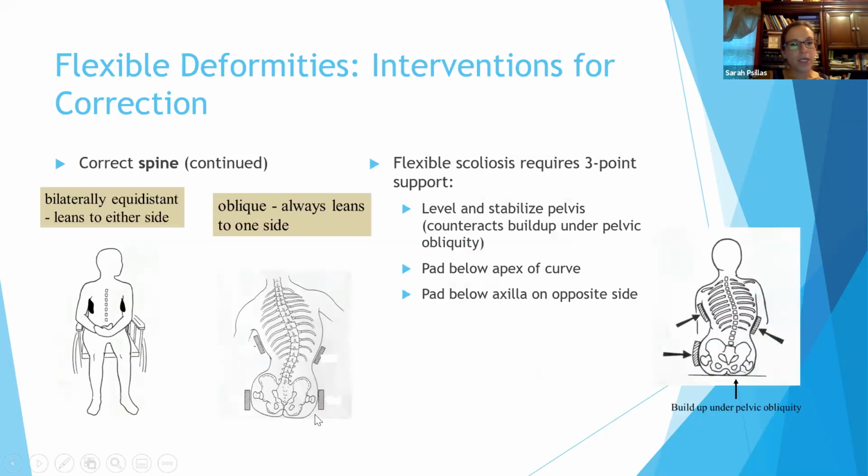This example is of a person who leans to one side. It's actually for scoliosis specifically. I'm going to move this so you can see it all. Okay. So when you're working with someone who has scoliosis or leans to one side, these are suggested placement areas for you to place lateral supports. So you want to make sure the pelvis is stabilized. So you can see here that this person on the left needed both sides, and this person on the right only needed on their left side.